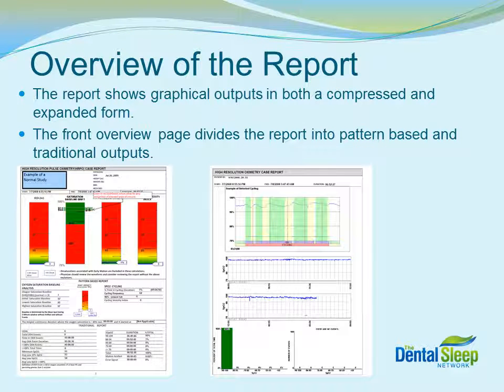The report on the patient has graphical input, both in a compressed and expanded form. Compressed format is on the first page and includes five key graphs that we'll review in more detail later. There are also several pages of expanded data. This information will not be covered in this module. The front overview page divides the report into pattern-based and traditional outputs.